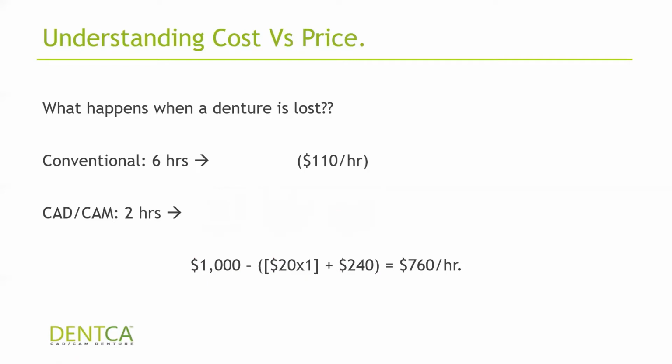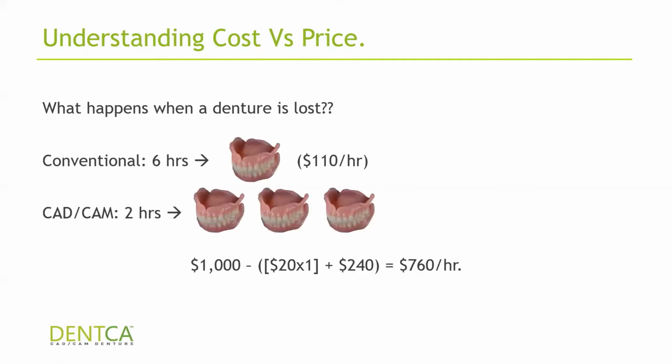So that is where the real earnings start to pile up, because you can add a lot of dentures with digital, where you cannot do that with conventional. Conventional means 1 set of impressions gives you 1 denture. With digital, you design it digitally so you can print however many as you need and then charge the patient the same amount of money.